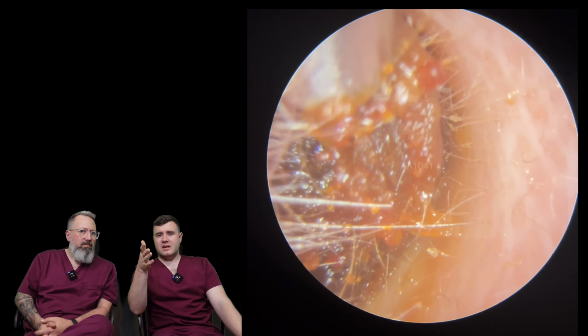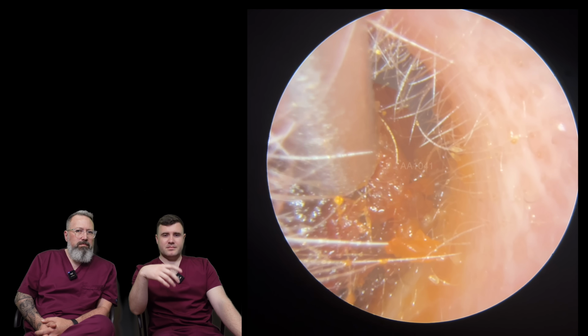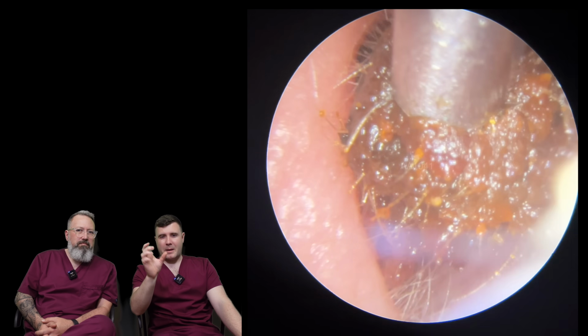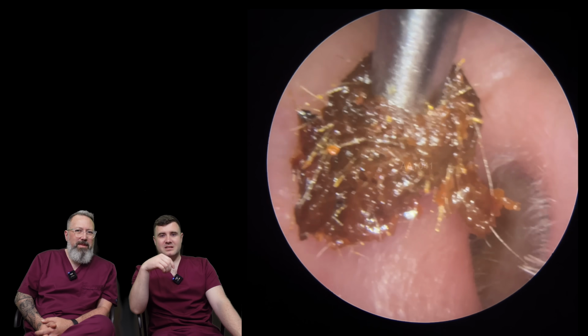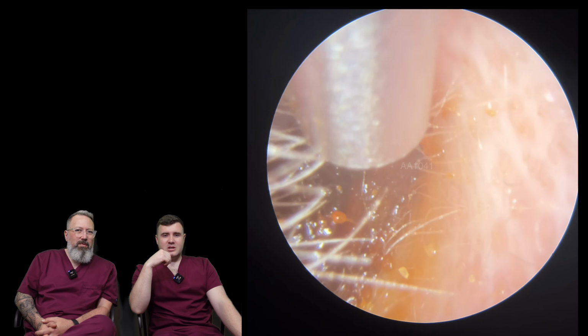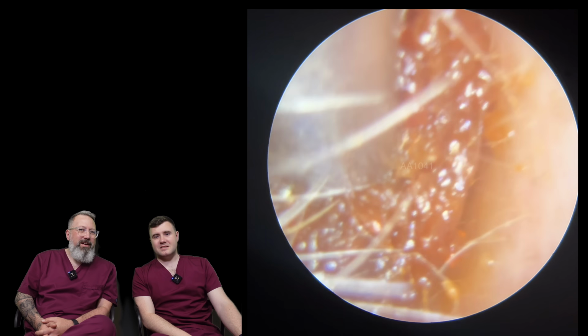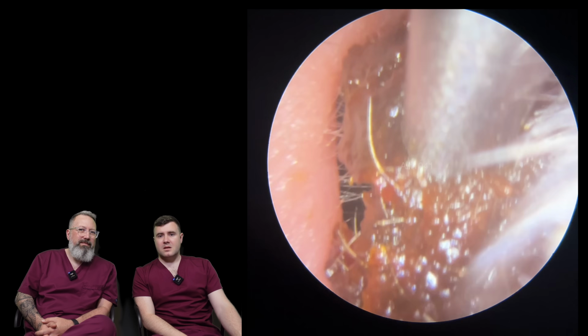Slight bend to the ear canal at the entrance there. I mean, there's nothing too difficult, but you normally tend to find that the wax gets trapped in those little areas. You can see it's literally just like an onion. It's just coming away in layers. This one's been very well behaved. It's all pulling forwards for you at the moment, isn't it? Have I jinxed you, in other words?